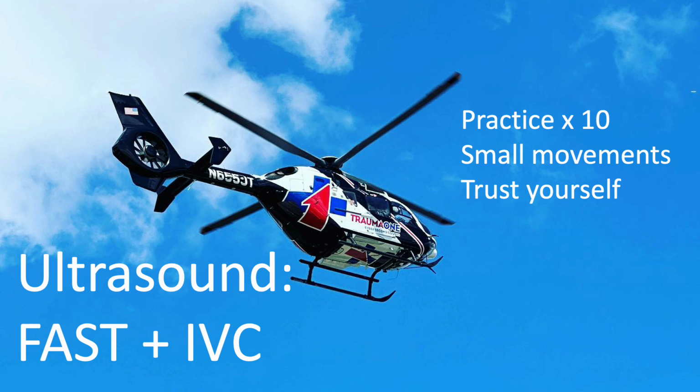You know what your hand's doing. You know based on your image what you need to do with the probe. That's where it all comes from. With that in mind, ultrasound's all about small movements. So anytime you're rotating to try to get a better picture, or sliding the probe to get a better picture, it's very fine movements, millimeters at a time, because you want to try to find a structure within your image and then augment to optimize that structure. So if you're moving centimeters to inches at a time, you're probably moving too fast and you're going to miss what you're looking for. And finally, trust yourself.